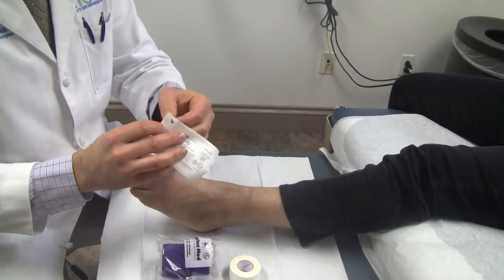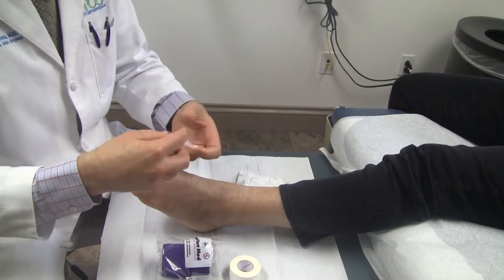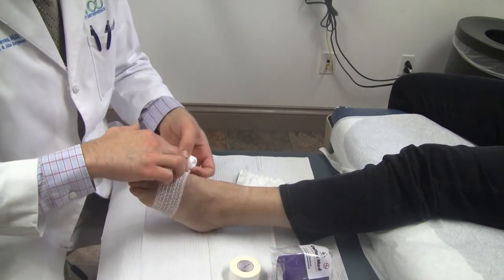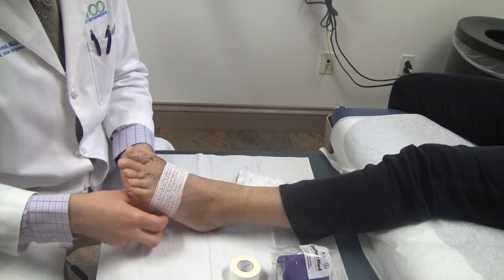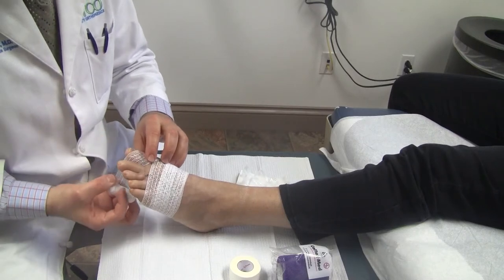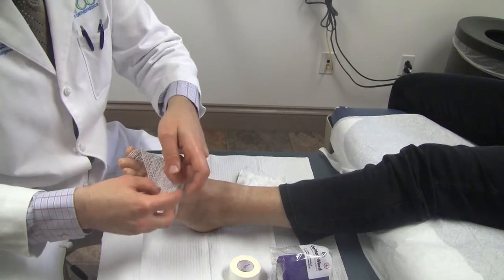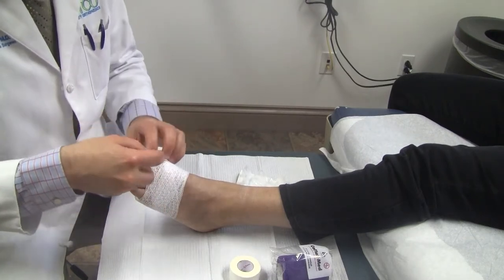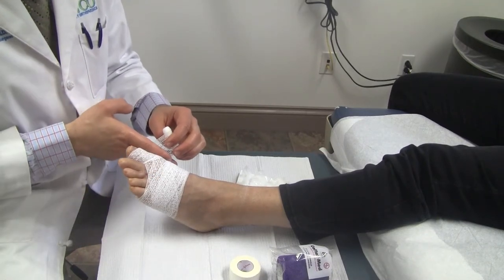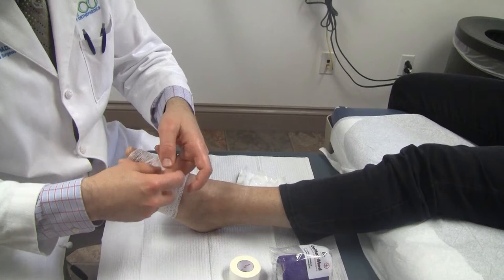When we do a tape and gauze dressing, we start with gauze to protect the skin from the adhesives in the tape. You start at the edge of your scar and wrap loosely around the foot. You want to get about two layers of gauze everywhere. We do loop around the big toe because that's where the tape is going to go. Keep things nice and loose — not too tight with the gauze. At this point I've now wrapped the toe and everything else with two layers of gauze. I could cut this off and save the rest for tomorrow's dressing, but for the sake of time I'll just finish this out and put a little extra gauze on her.